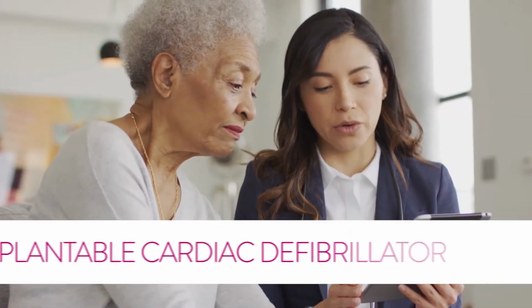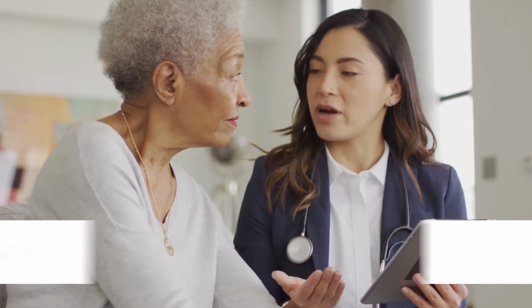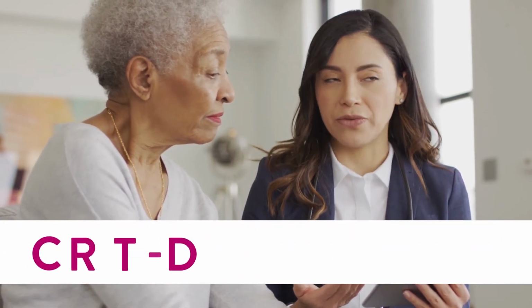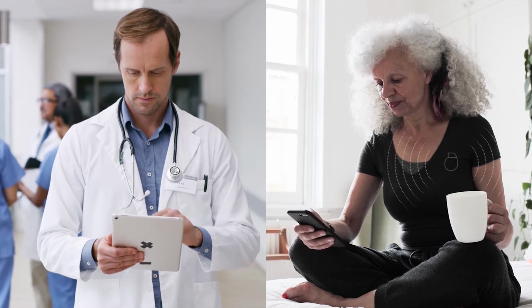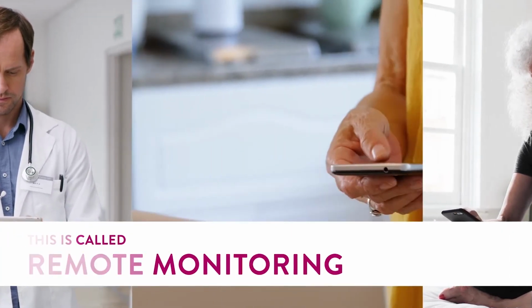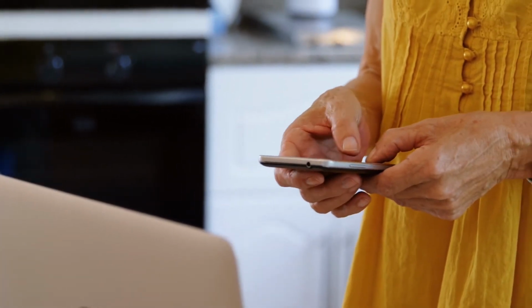After you receive your Abbott implantable cardiac defibrillator, an ICD, or a cardiac resynchronization therapy defibrillator, a CRT-D, you can use the myMerlinPulse app on your smartphone to collect your heart rhythm information and share it with your doctor. This is called remote monitoring. Before the app can remotely monitor your heart, it needs to be paired with your device.